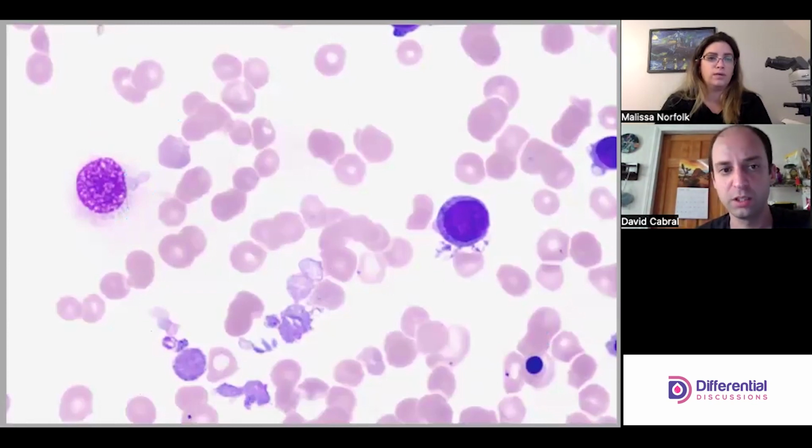And the way this is usually counted is you count it like you would count NRBCs. So you tally them, the number that you see per 100 white cells counted. They're not counted as part of your 100. And if you're correcting your WBC count for their presence, it's the same formula as we've discussed in the past. You do have to correct it when you see a lot of these and the white cell count wasn't corrected for it by the instrument.